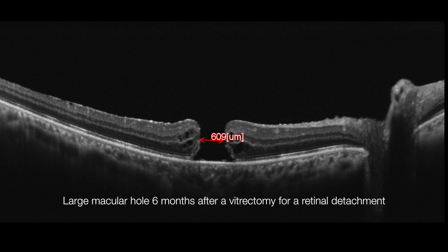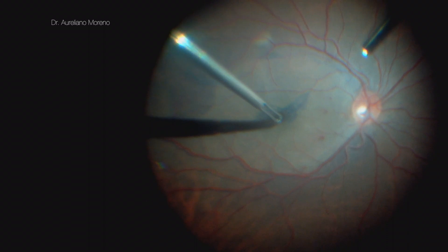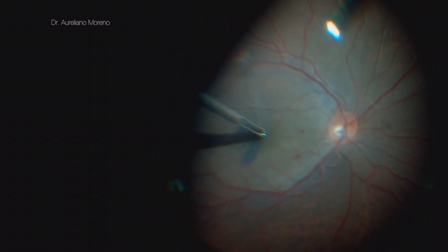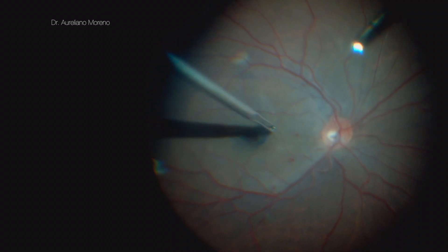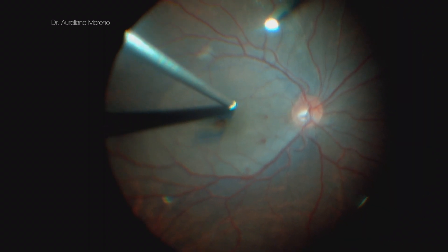The second case is a large macular hole 6 months after a vitrectomy for a retinal detachment. After implementing the modified inverted ILM flap technique, I check to make sure that the flap is attached to the edge of the macular hole only. Do not try to insert the flap or massage the edges of the macular hole.